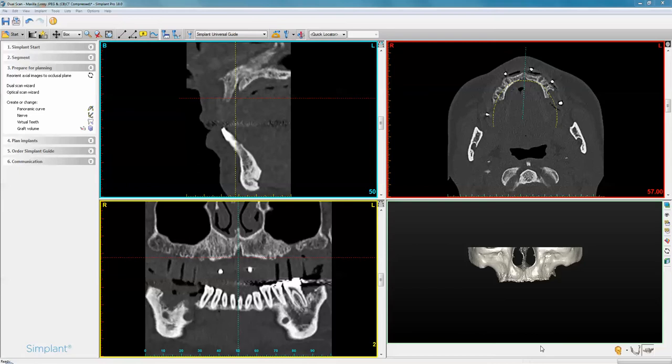The first scan is of the patient wearing radiolucent dentures with radiographic beads attached to it. The second scan is of the denture on its own — you take the denture out of the patient's mouth with the radiographic beads still attached and place it in the CBCT scanner.